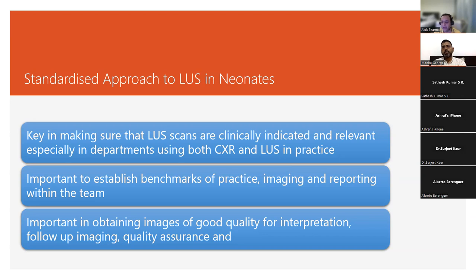So it's very, very important that you standardize a few things. How you do it, which probes you're using, what frequency you're using for which indication, what regions and how you go about doing the scan. But more importantly, I would say, really how you record and report that scan, because actually that's quite crucial. If you start reporting in different ways, it just makes things quite messy. More importantly, it can actually alter the way somebody might interpret your findings in a scan, as well as your report 12 hours later if he's repeating that scan.